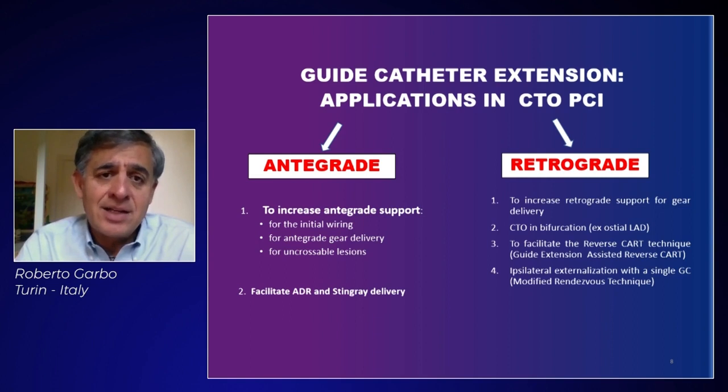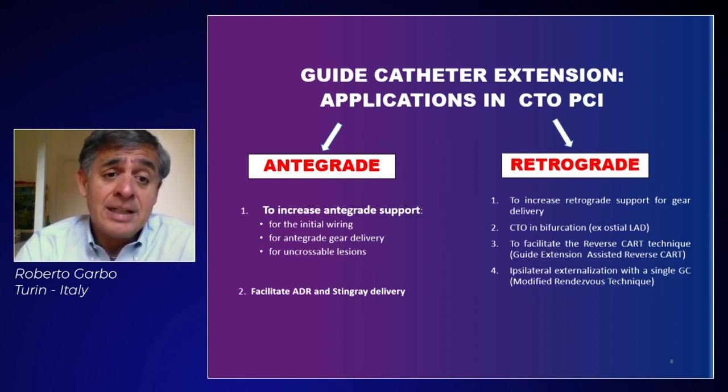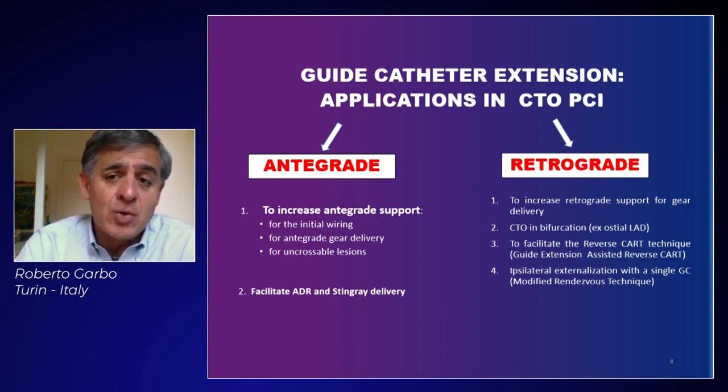So, guiding catheter extension applications in CTO PCI. We have the anterograde approach and the retrograde approach, and we have many useful situations in the anterograde approach: for wiring, for device delivery, for uncrossable lesions, or also for the new facilitated ADR with Stingray or Recross delivery. In the retrograde approach, also to increase the retrograde support, in bifurcations, and for reverse CART.